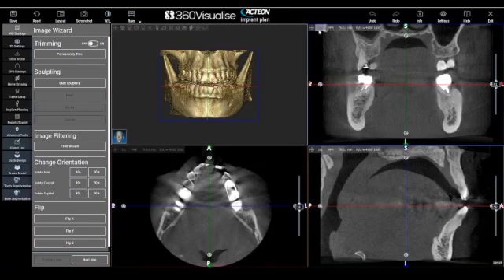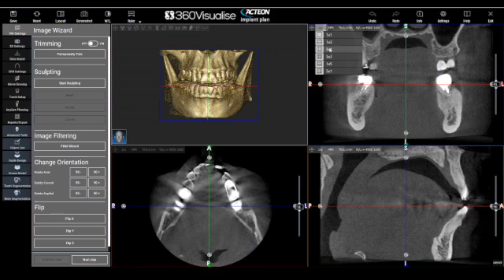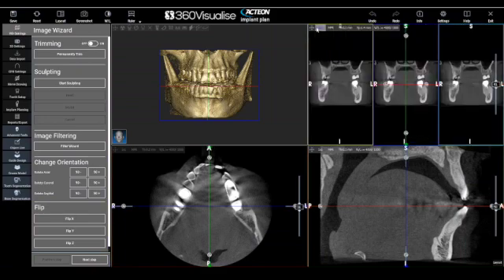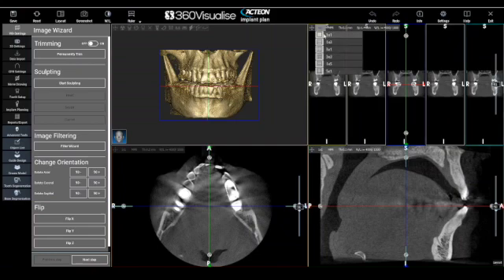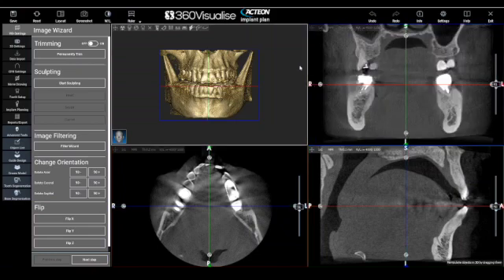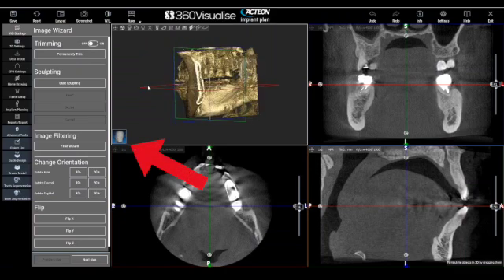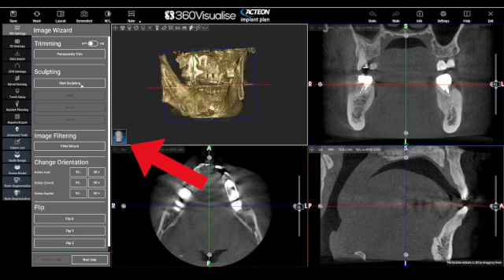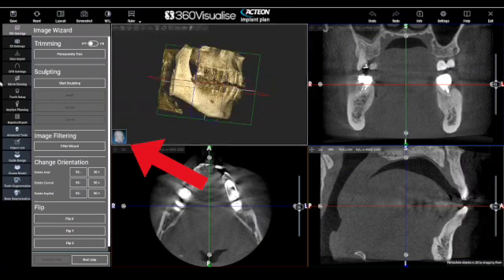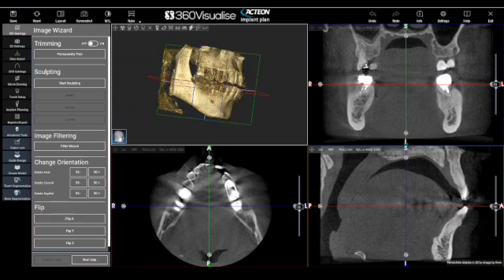You can also change the number of slices shown. We can move the 3D render by clicking and dragging the mouse. As we do this, the head icon below also rotates. We can click this icon to snap to any one of the views.